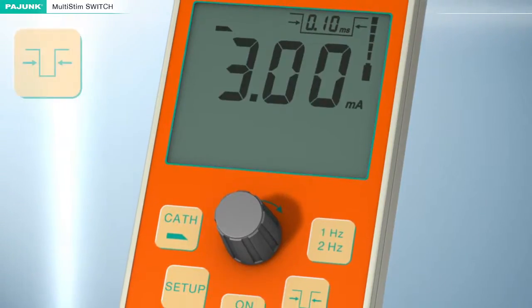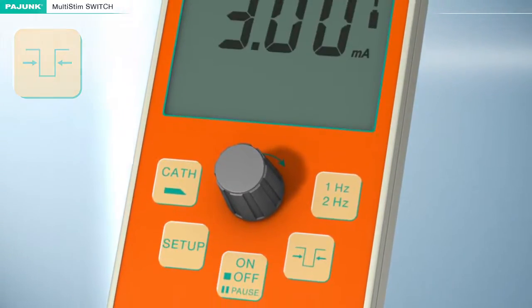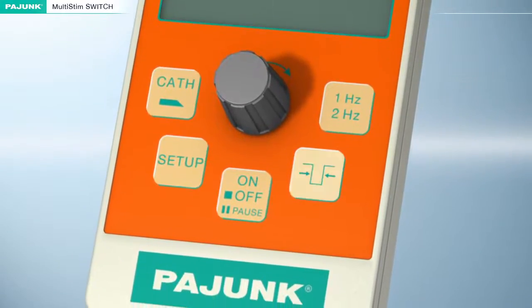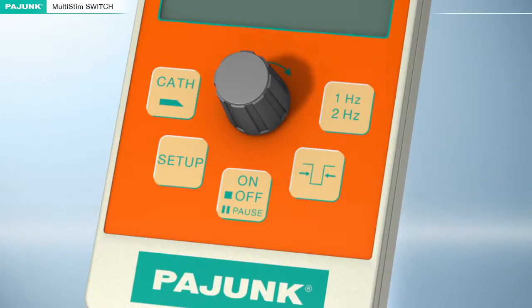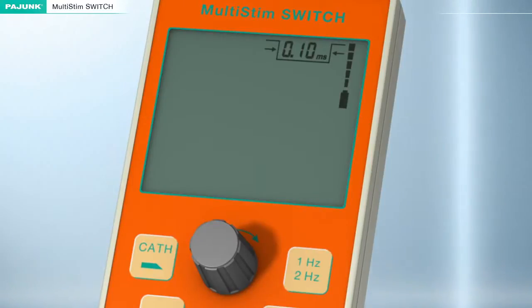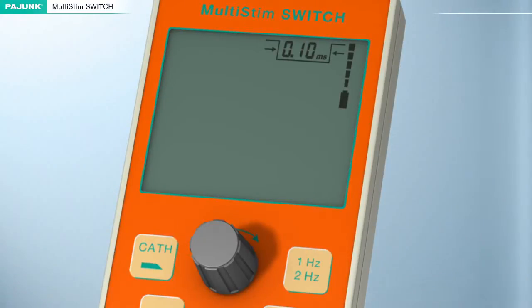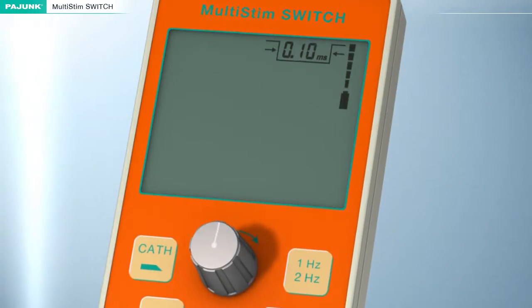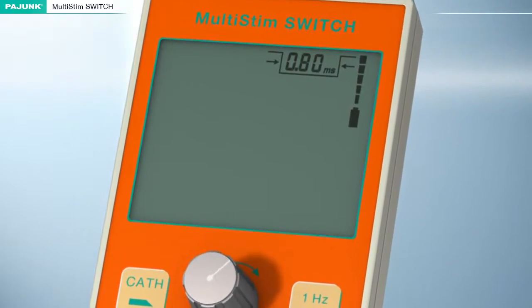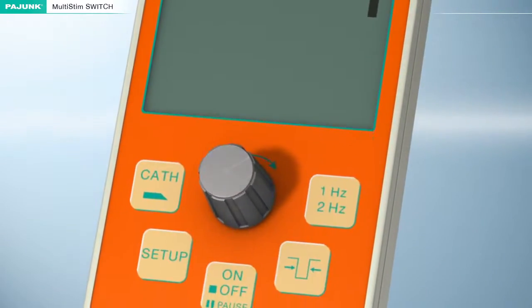Pulse Width. The bandwidth of the stimulation impulse can be changed by pressing this button. The value of the current intensity and the milliampere dimension will disappear from the display. Now, the stimulation impulse bandwidth, indicated in the upper right-hand corner of the display, can be adjusted to the desired value between 50 microseconds and 1.0 milliseconds with the aid of the turning knob.